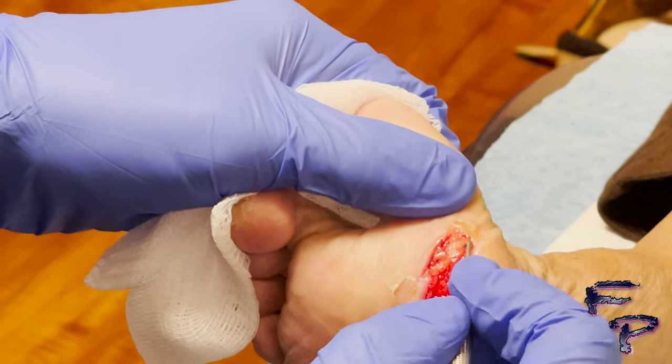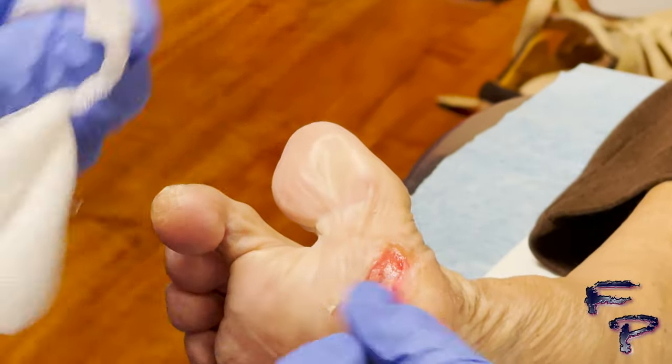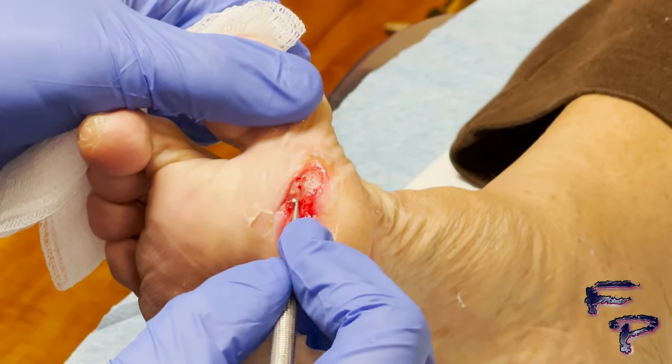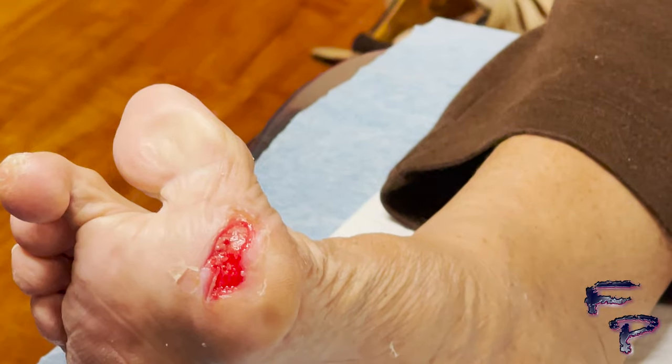Each physician does this differently and uses different instrumentation. Utilizing goggles is very important, as blood may splash.